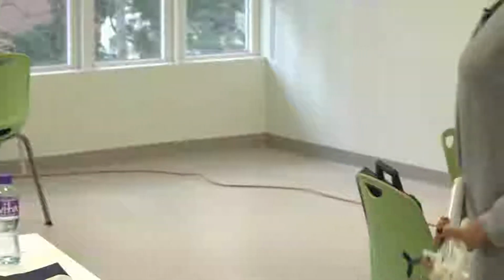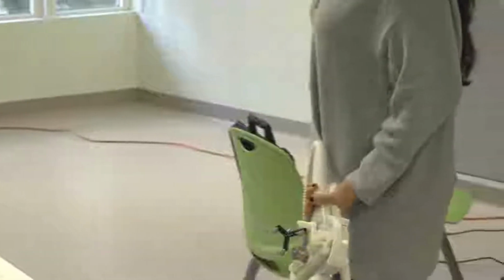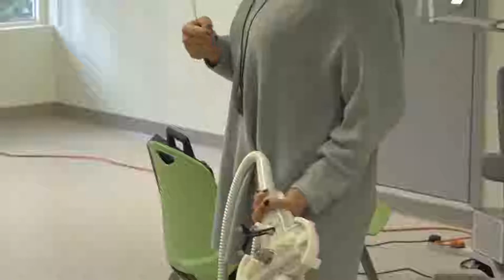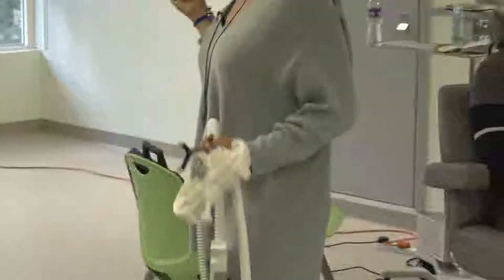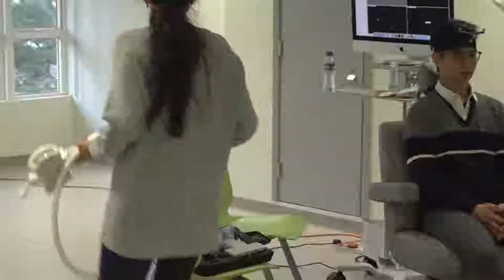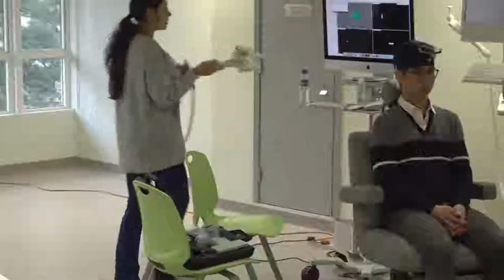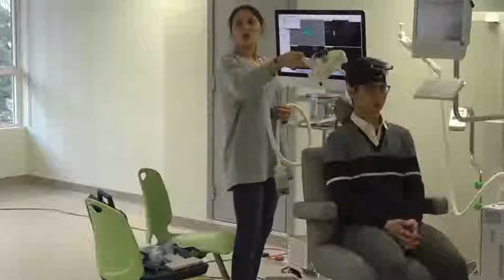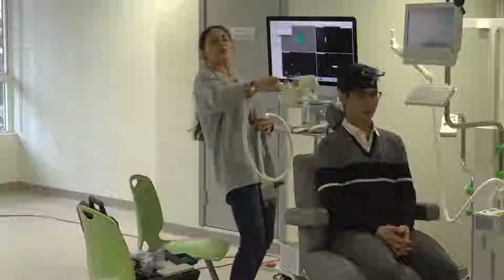Now my reference is Joseph. So everything will be around Joseph. If I move the camera or I move the coil, it doesn't matter as long as Joseph is always in view and is the center. Let's see if this can be seen. So you see now the coil appears here, yes? Okay.